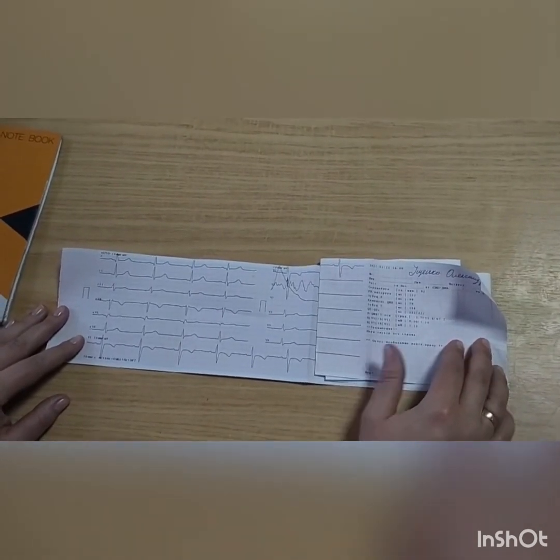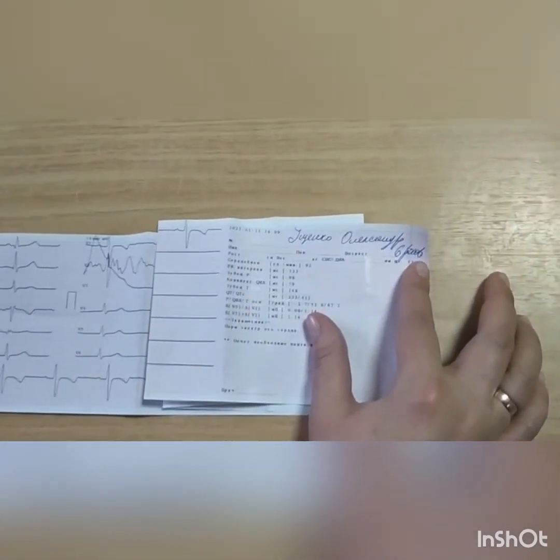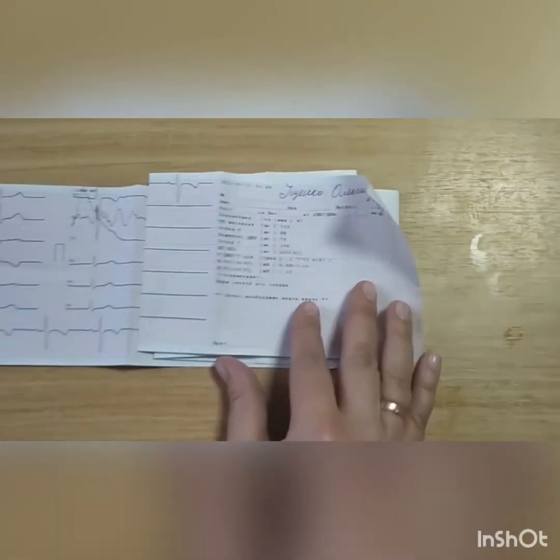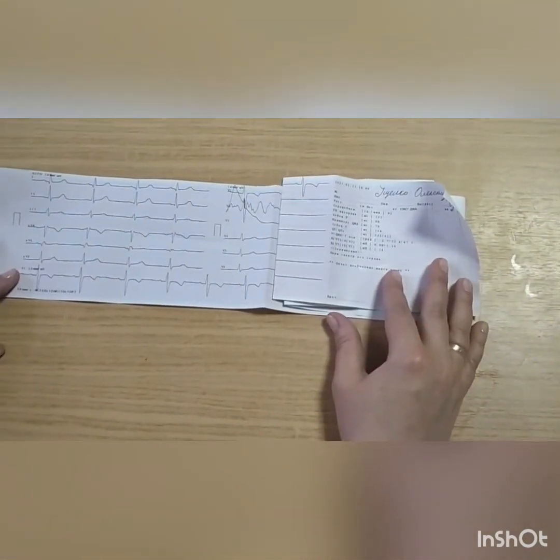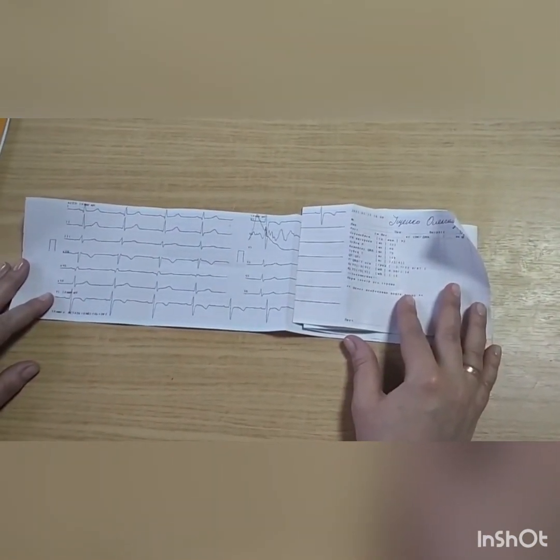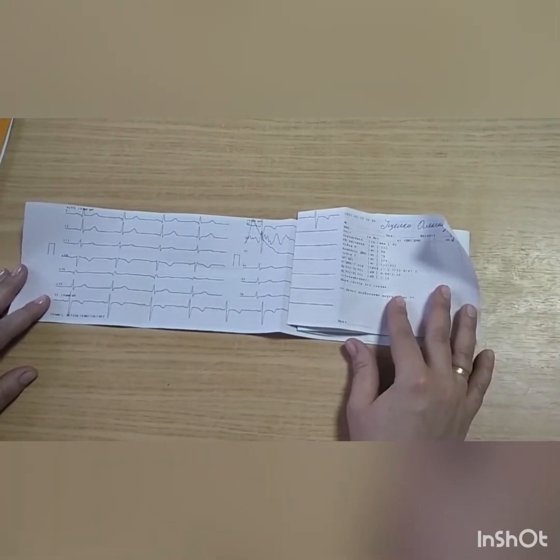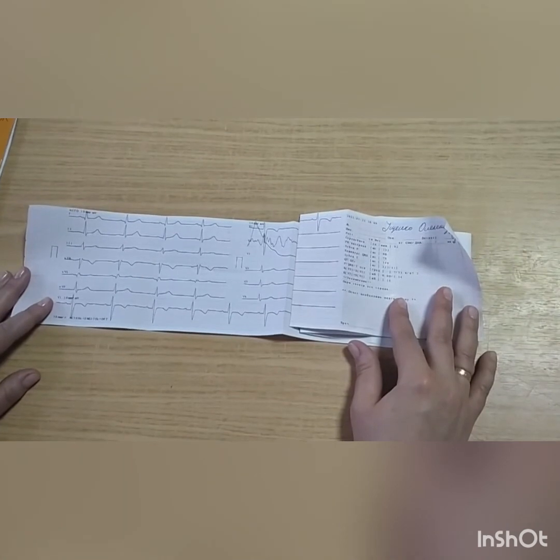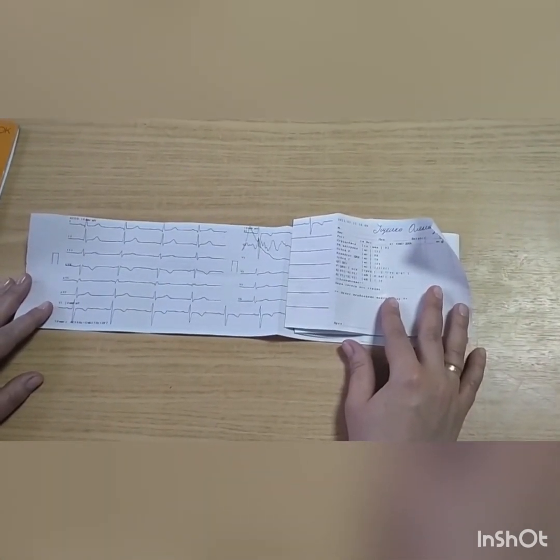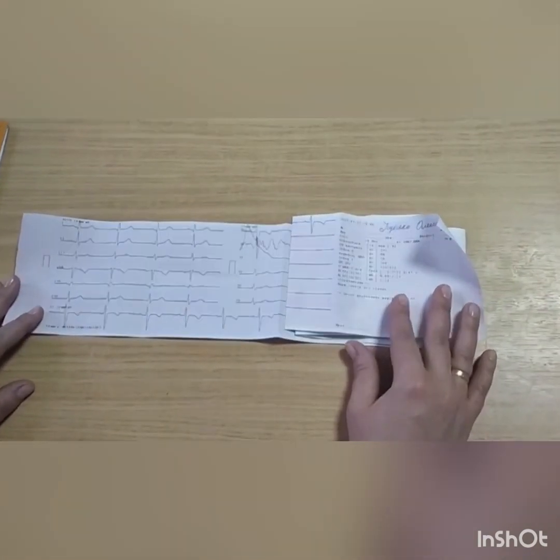I would like to draw your attention to the fact that on each electrocardiogram we indicate the patient's passport data: last name, first name, and age. Further, the electrocardiogram is transmitted for evaluation to a functional diagnostic doctor or cardiologist. After the conclusion of the specialist, the electrocardiogram is transferred to the patient's hands and stored in the outpatient card in order to be able to evaluate the previous electrocardiograms and subsequent ones, since it is important to evaluate the EKG in dynamics.